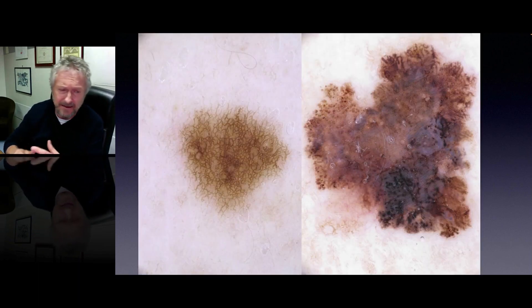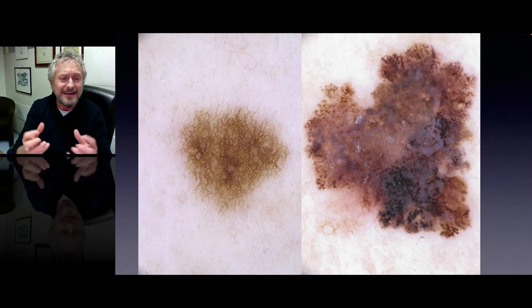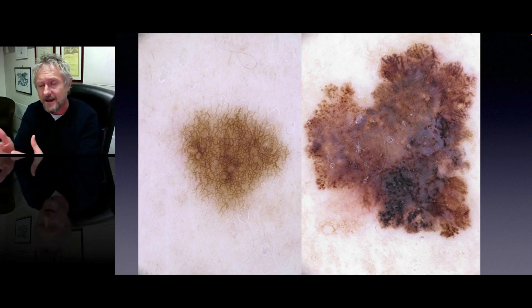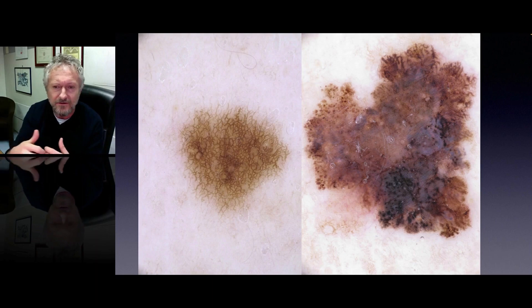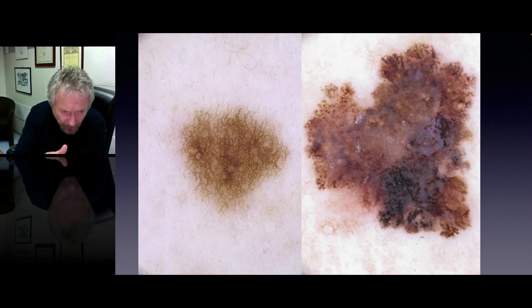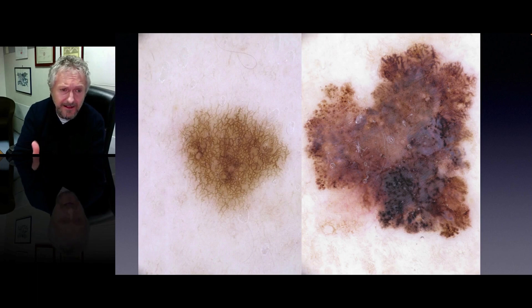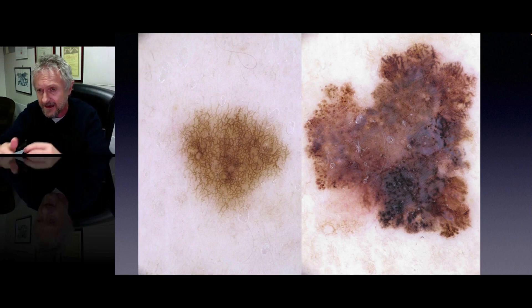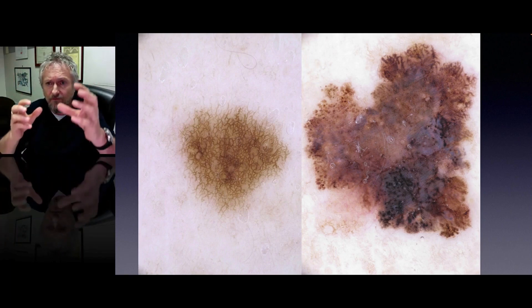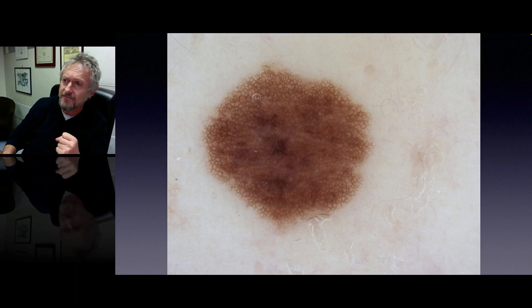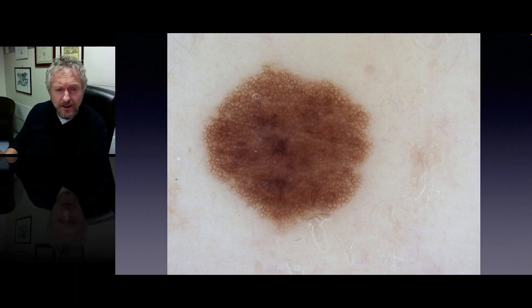Just to make an example: on the left side, the overall architecture of this lesion is completely symmetric and very regular — there is an order behind this lesion — while on the right side there is a crazy lesion; the overall architecture is completely asymmetric in terms of distribution of colors and structures. The specific clue on the left is the presence of a regular pigment network, meaning we are dealing with a melanocytic nevus. Order plus specific clue network means nevus. On the right side, overall architecture is crazy, and the presence of globules and network makes this a melanoma.